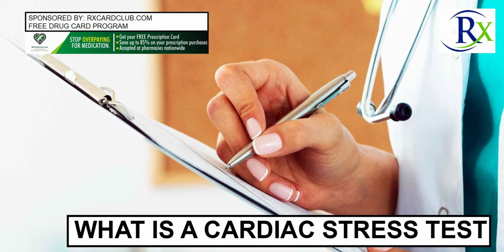Most people are able to complete a stress test without problems, and they then wait for the results. If there are abnormal findings on your stress test, it's likely that other tests will be needed to confirm a diagnosis. Your healthcare provider will then work with you to develop a treatment plan.